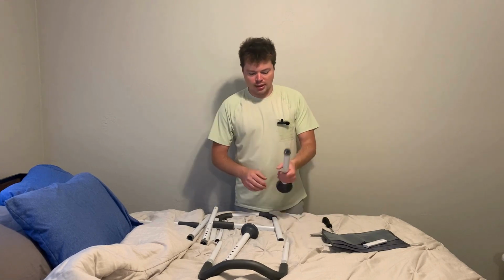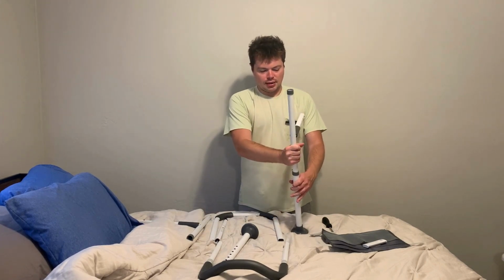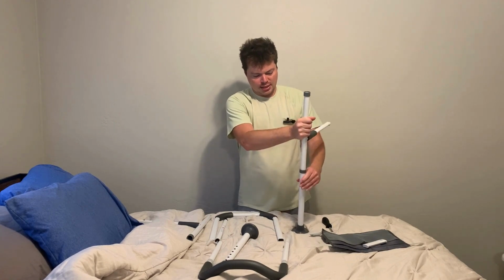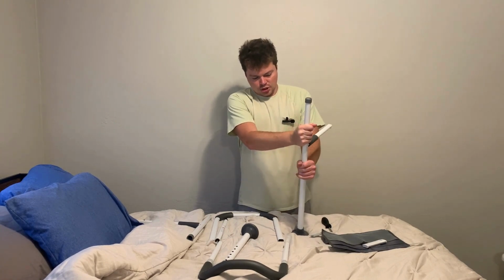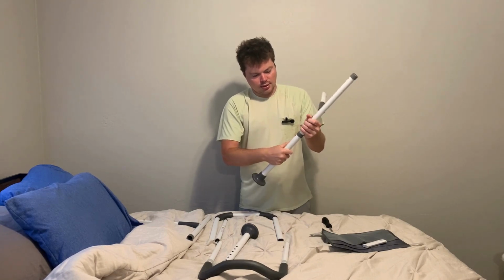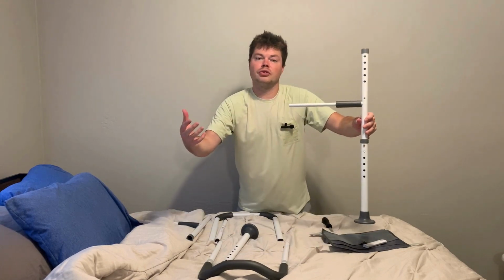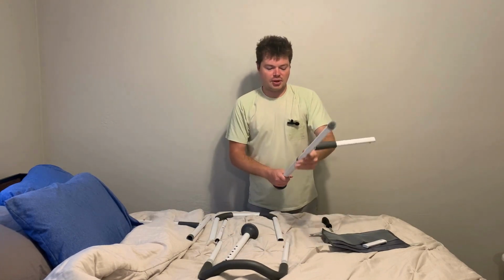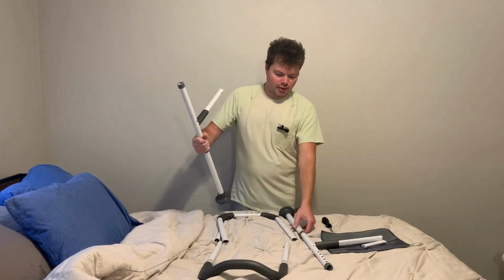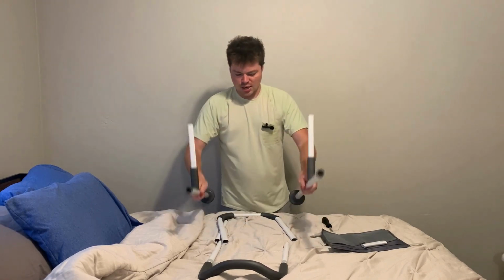So you're going to start with the legs. Very simple. Just take your first base of the leg and extend that piece in there. And it should just pop into place. There you go. And you'll see there's a bunch of different heights that you can choose. So whatever's going to work for your bed, you'll be able to get that fitted for you. All right, now both legs are secure and we can move on to finishing the base.